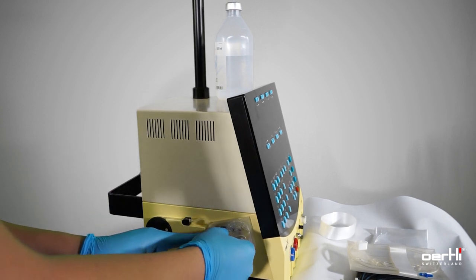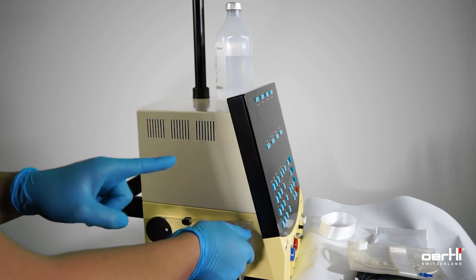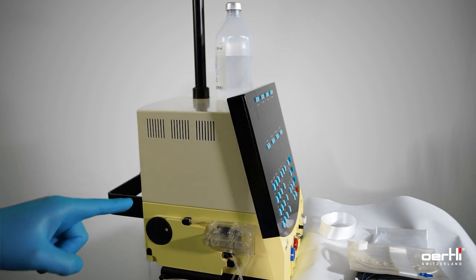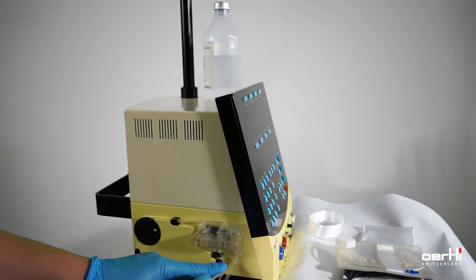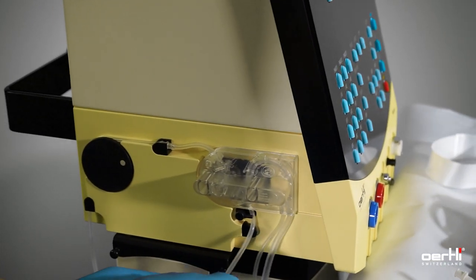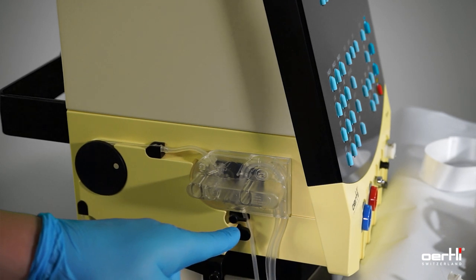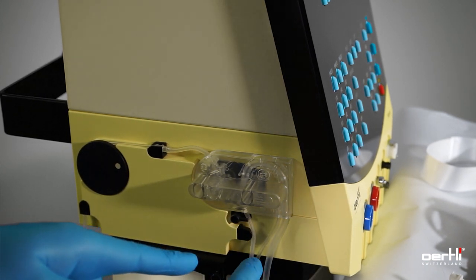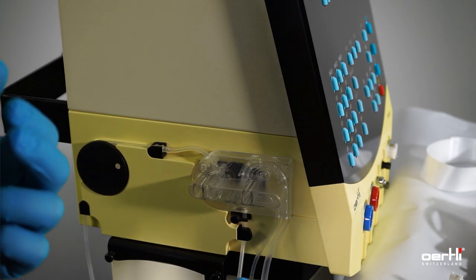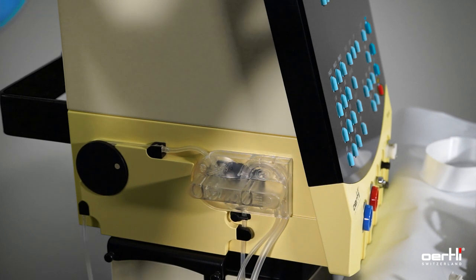Release the tubing so it's not sterile anymore, but you don't have to touch it anymore. Go ahead with the cassette and press it down until you hear the click. Grab the small tubing here and install it in between the irrigation valve. You should also notice a click sound. That's it — the cassette is installed.